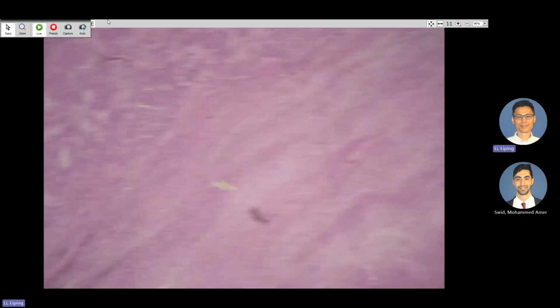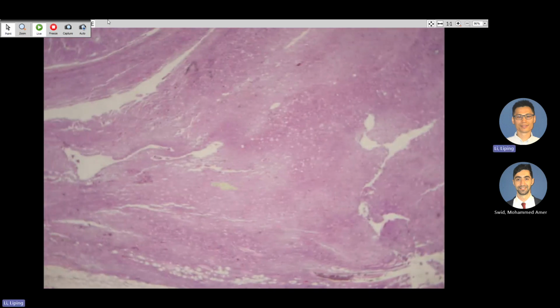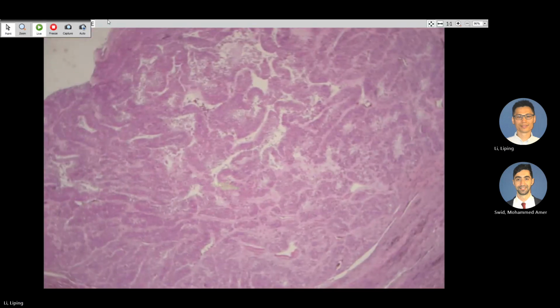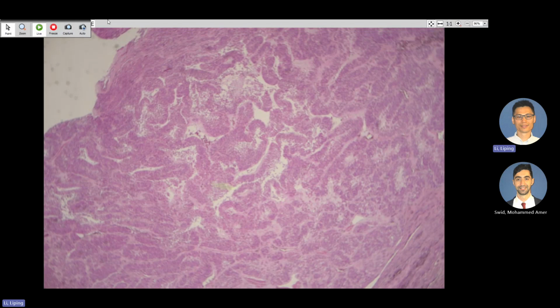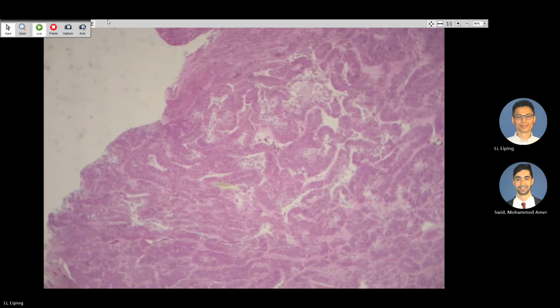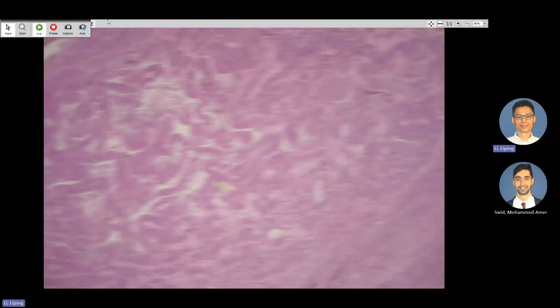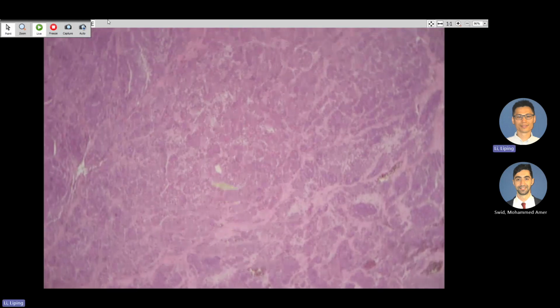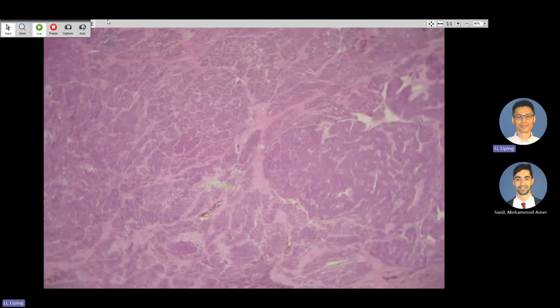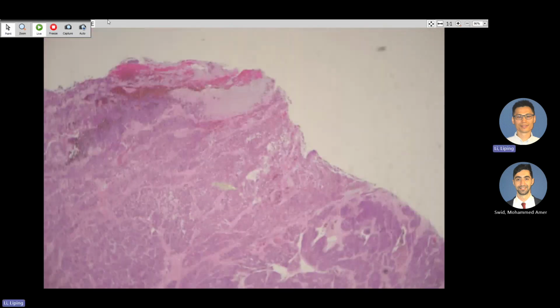This one looks like normal adrenal gland. We have this, almost forming some of the rosette thing, this kind of rosette and the oncocytic changes. And then, still in low power for a while, some areas look like necrosis here. And then it's really bloody in this one.